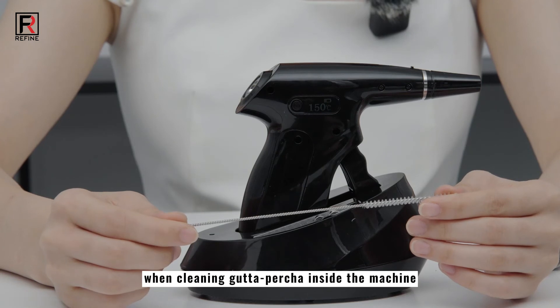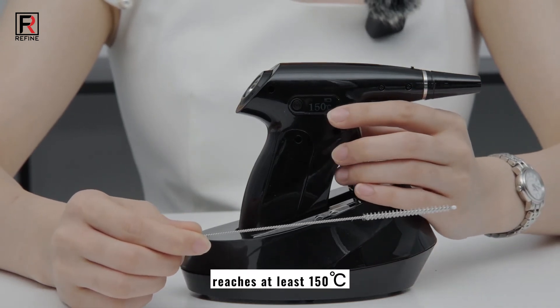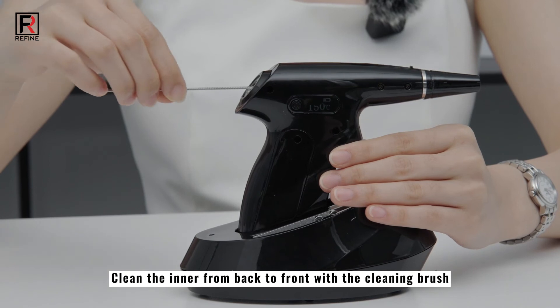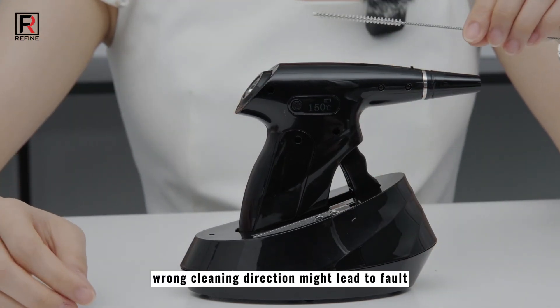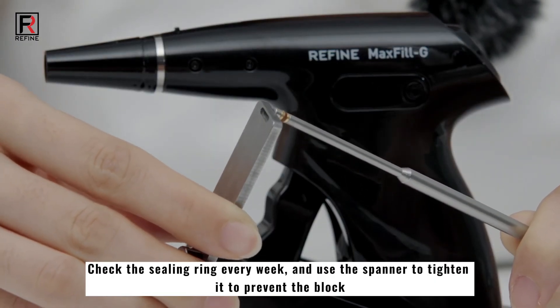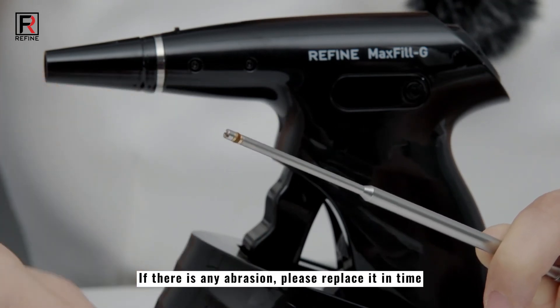The surface of the gun should be cleaned with phenol-free disinfectant. When cleaning gutta percha inside the machine, please ensure the temperature reaches at least 150 degrees Celsius. Clean the inner from back to front with the cleaning brush; wrong cleaning direction might lead to fault. Check the sealing ring every week and use the spanner to tighten it to prevent blockage. If there is any abrasion, please replace it in time.